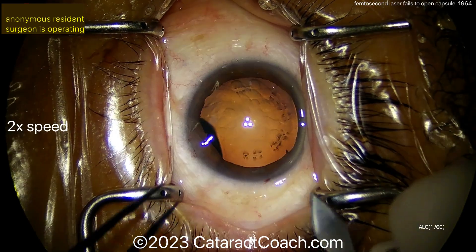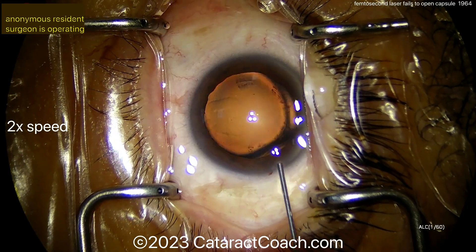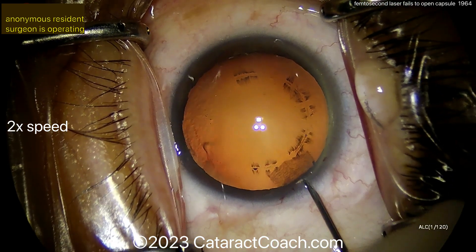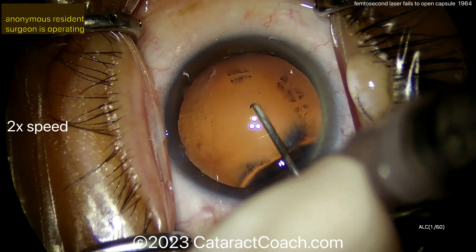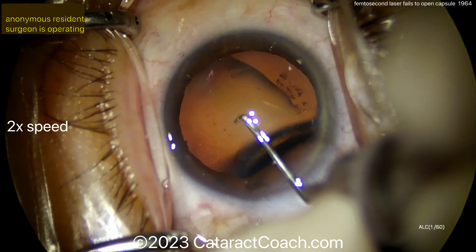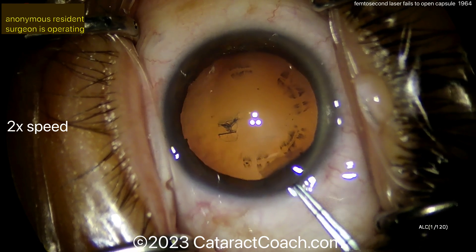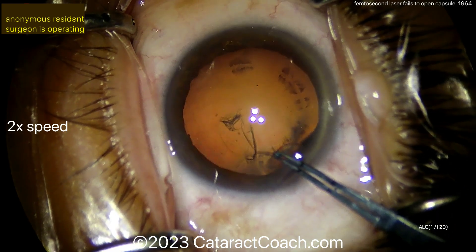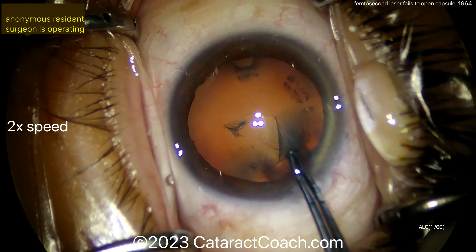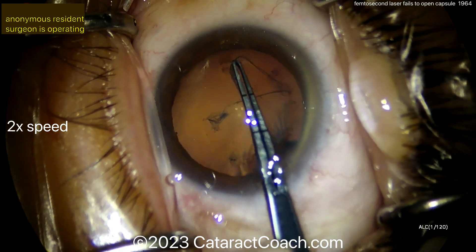That's why you have those skills and why you learned them. When you do this manual capsulorrhexis, think about it — you could already have some opening of the lens capsule, and the laser makes small perforations like a postage stamp. My advice is to do a large rhexis: make sure your rhexis is larger than that area and encompasses the area of partial laser treatment. If you do a small rhexis inside those laser spots, and those areas break, you can have an uncontrolled situation — a capsule run-out zipping to the posterior capsule.